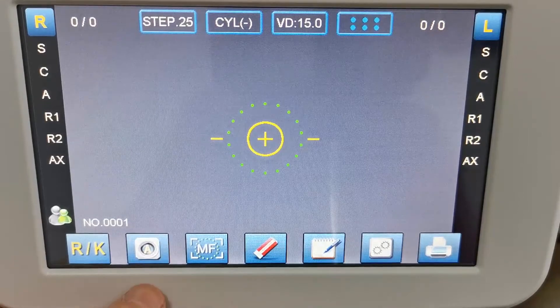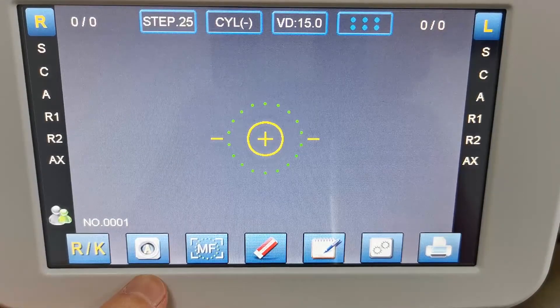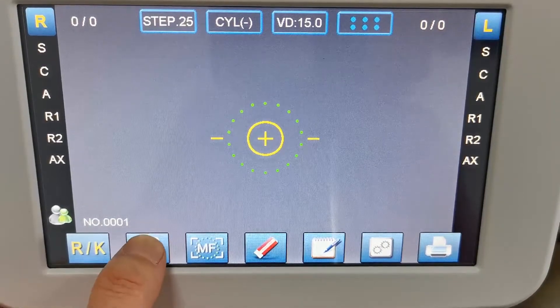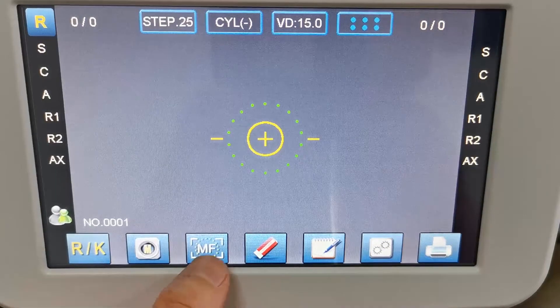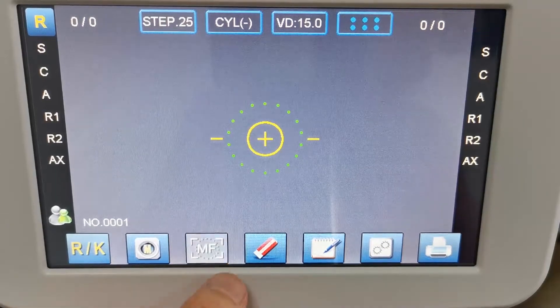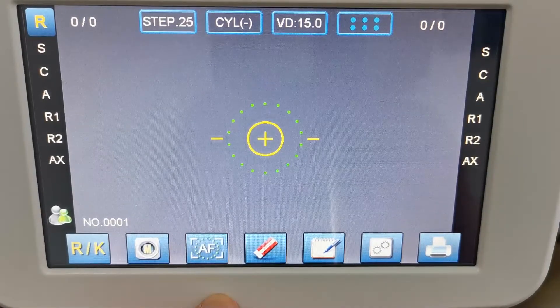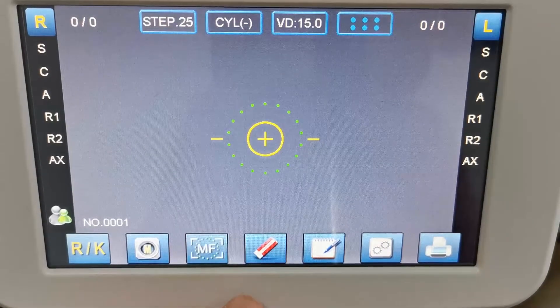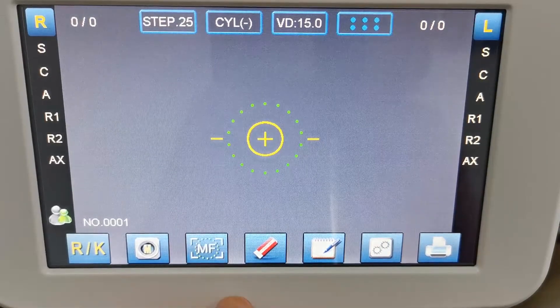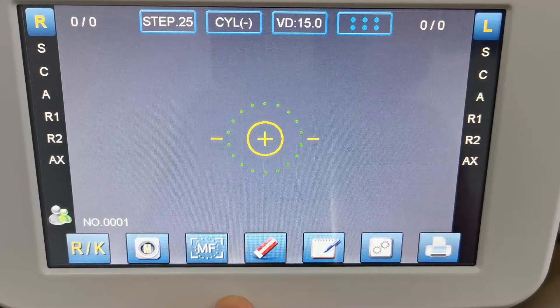Here is the auto tracking menu tracking switch. And here is the auto focus menu focus switch.